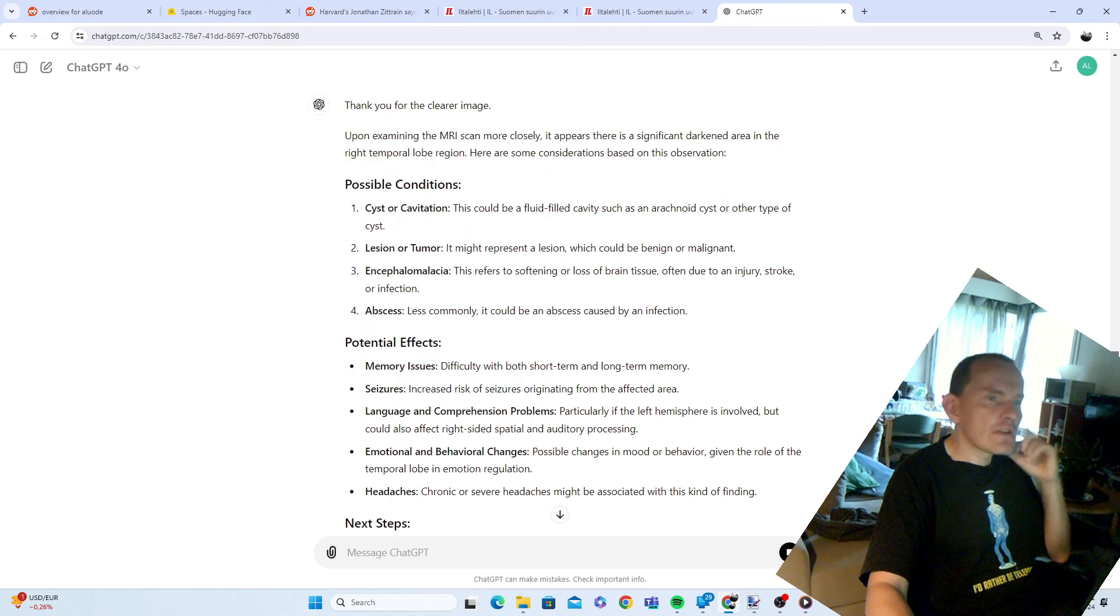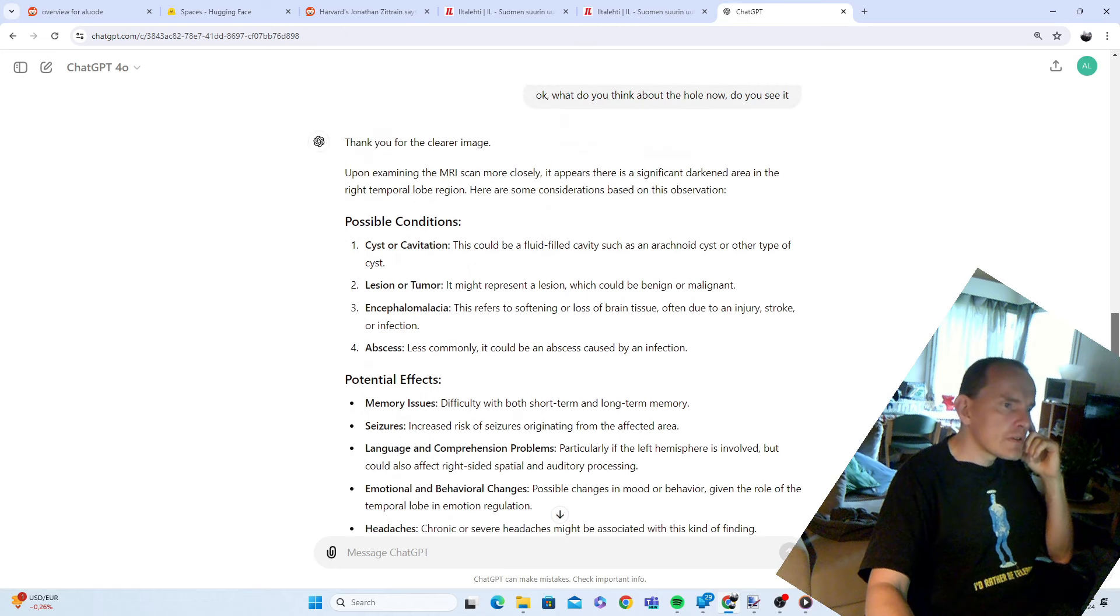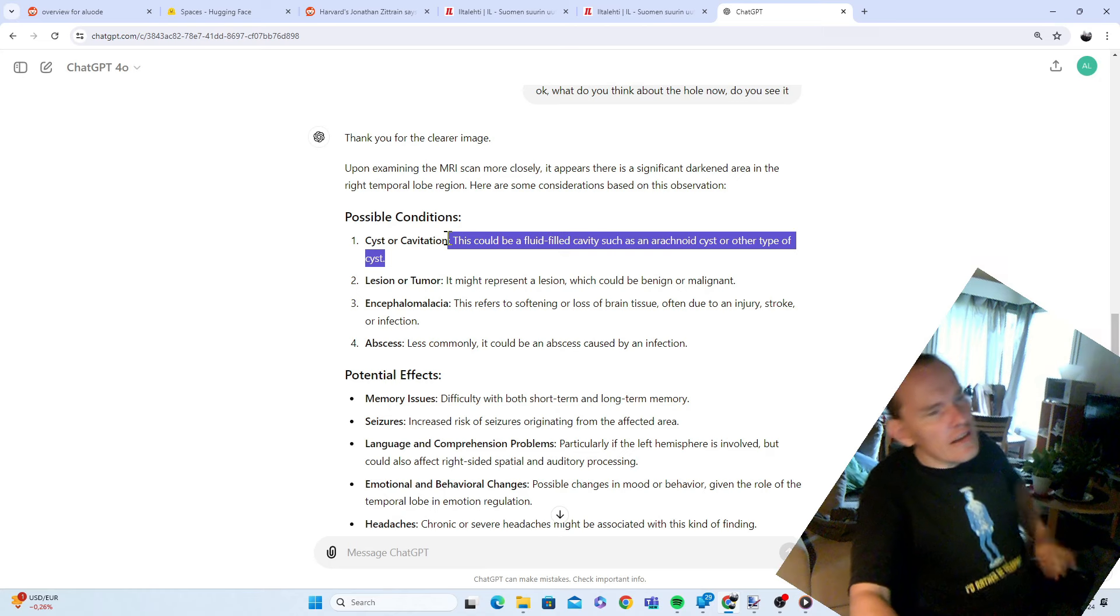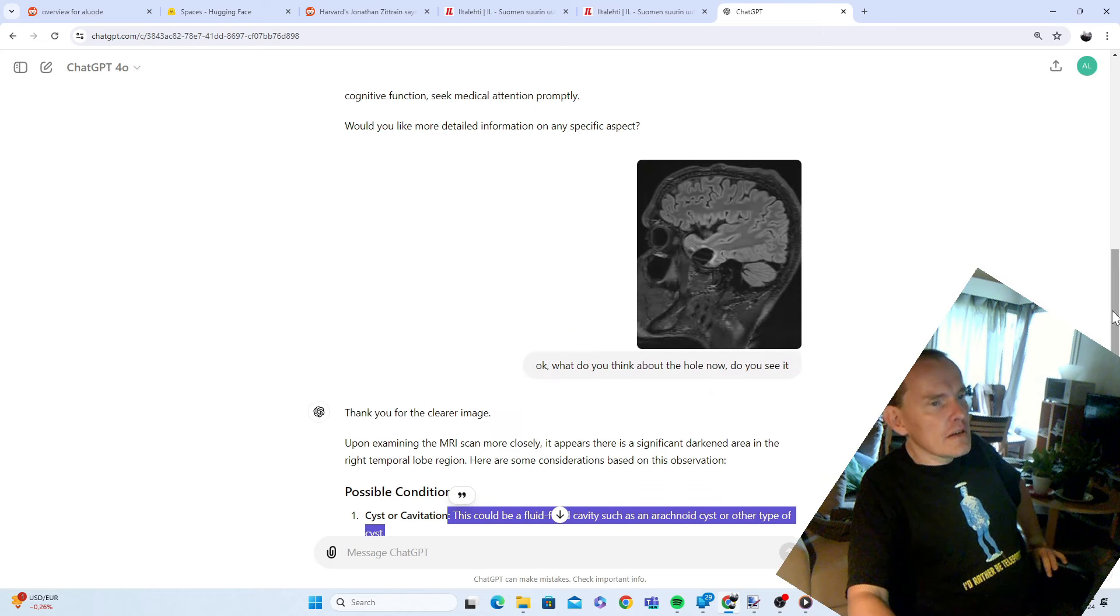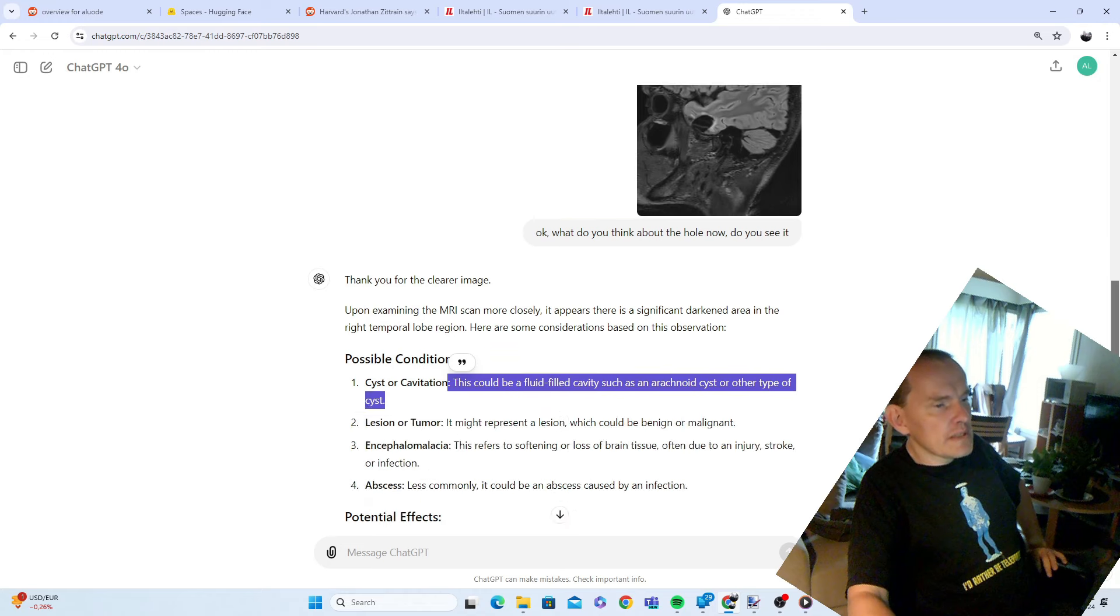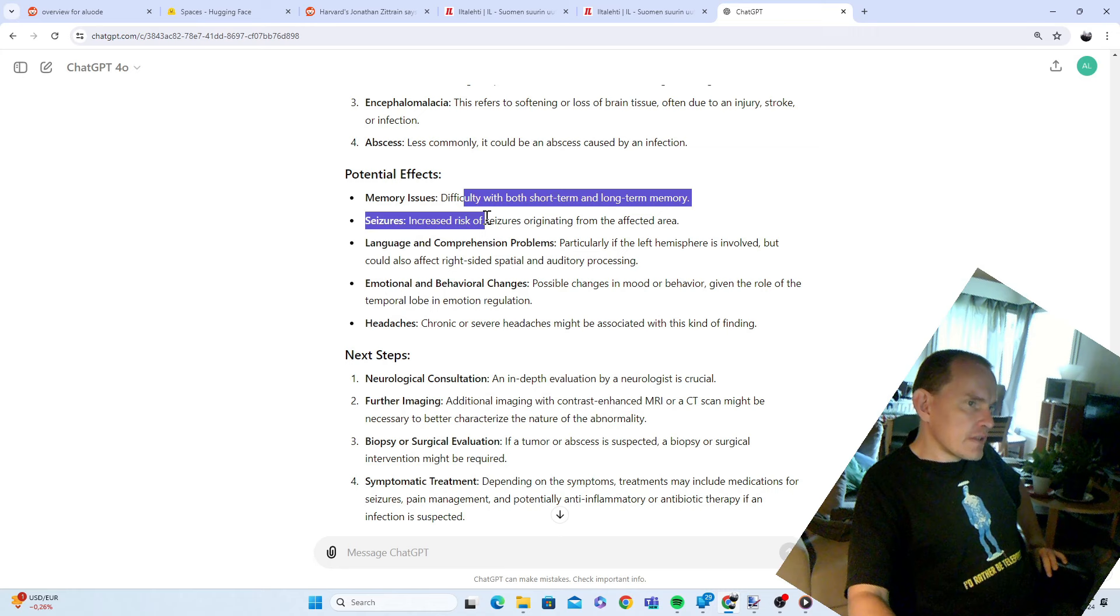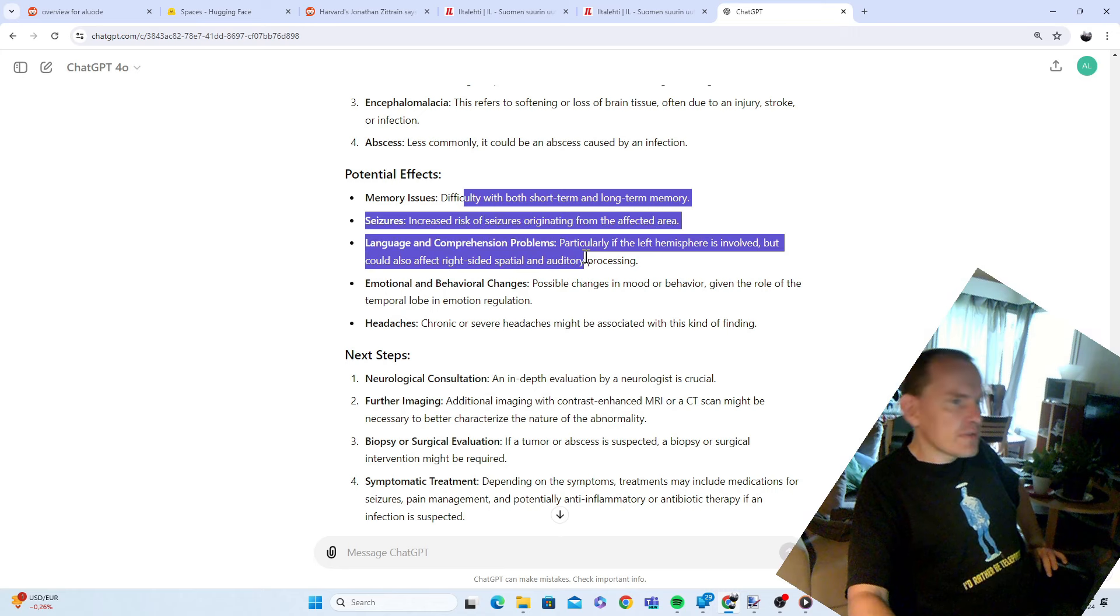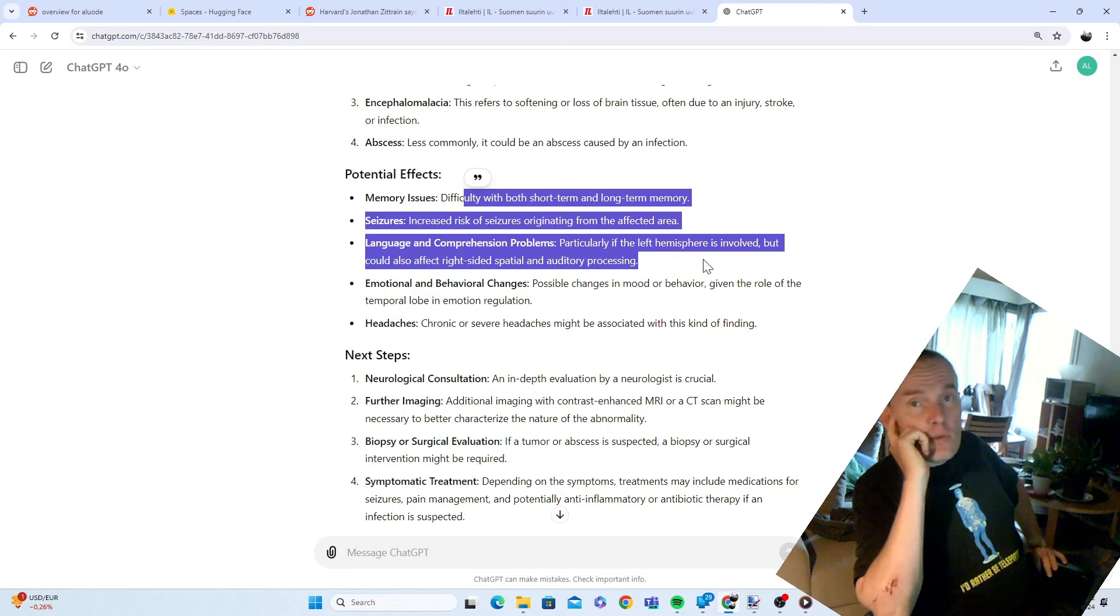There is a significant darkened area in the right temporal lobe. This could be a fluid filled cavity, which is what it is because there was an operation to remove it. Effects could be memory issues, difficulty with both short-term memory and long-term memory, seizures, increased risk of seizures originating from the area, language and comprehension problems.